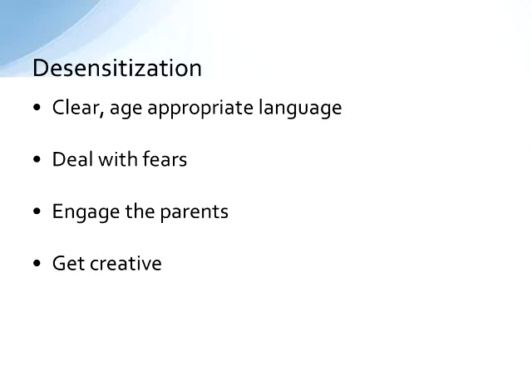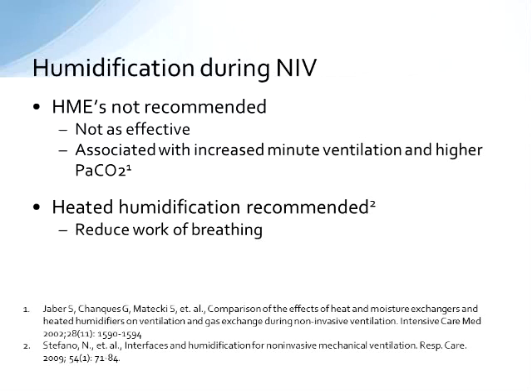But it's important, again, to engage everyone in the care team around the education and to hopefully allow the child some time to play with it. Again, if it was an impending respiratory failure situation and you did not have that luxury, get that child on the mask, and maybe while they're on the mask you could take the time to chat with them while they're being cared for with the machine. So a very, very important aspect of non-invasive ventilation is desensitization, as it leads to compliance.